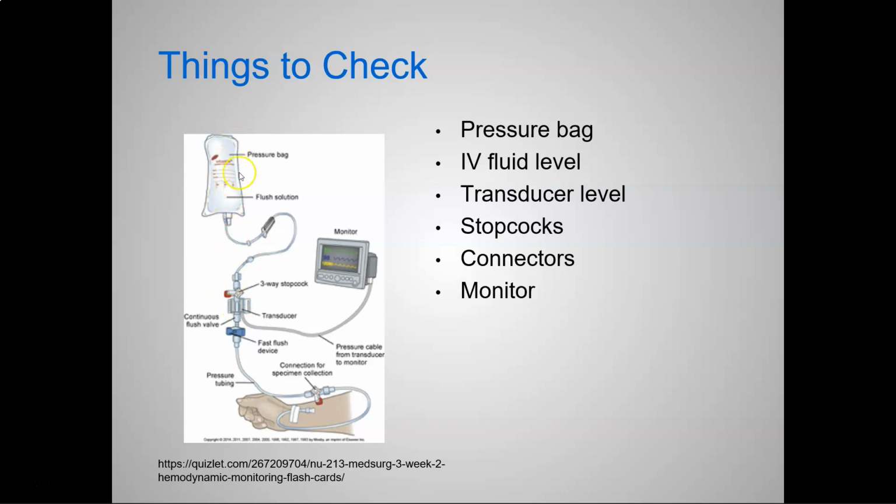But here we go. Pressure bag, NS or heparin. Typical IV tubing. Even have our little stop here. Cool. Three-way stopcock to the bag, to the patient, to the monitor. Okay, transducer. Remember, phlebostatic axis, please. And there are different locations for the flush device. Some transducers have it in the dead center, like ours at St. Mary's.